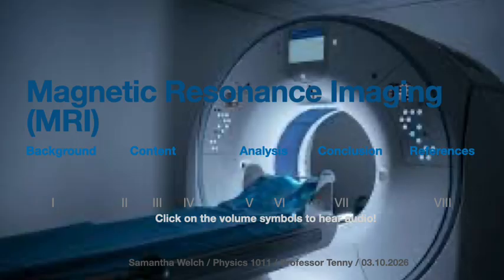We will now begin reviewing basic physics concepts behind the MRI scanner. According to the textbook we have been using in class, University Physics Volume 2 from OpenStax, we were able to learn that magnetic resonance imaging is successful through studying the atomic nuclei behavior when they are placed in strong magnetic fields and exposed to radio frequency waves.